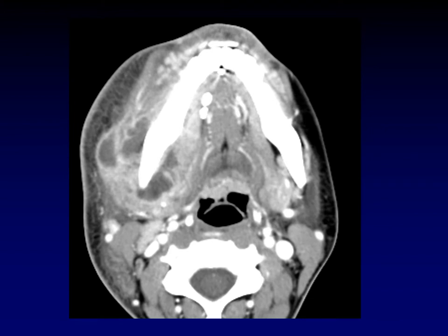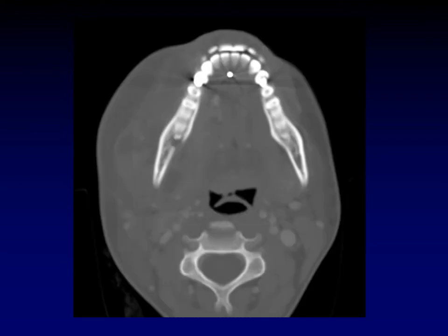This is a more classic appearance of an abscess in the masticator space. Again, you can see how it's displacing that parapharyngeal fat posteromedially. When you see an infection in the masticator space, the most likely culprit is going to be the teeth, like this periapical abscess. You can see the break in the cortex through which the infection has spread into the masticator space.